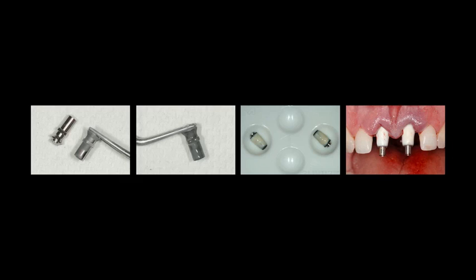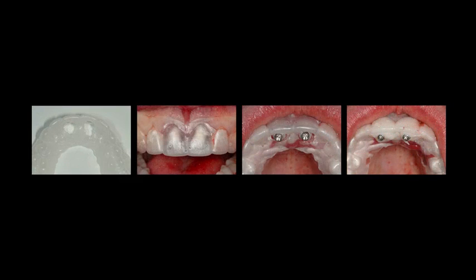These are provisional posts, and I opaqued them. Today they have the meso abutment, which is tooth colored, but back 4 years ago they had these posts, and basically I opaqued them with the Creative Color opaquer, and then we took some extra long screws, and the screws basically come out the end of the posts long enough that I can then use a shell that represents the tooth form that we want to achieve with the provisionals and have holes in the shell, and then I can basically unscrew the provisional complex.